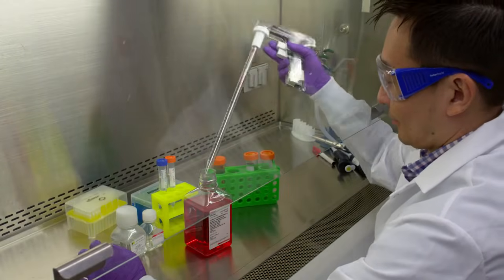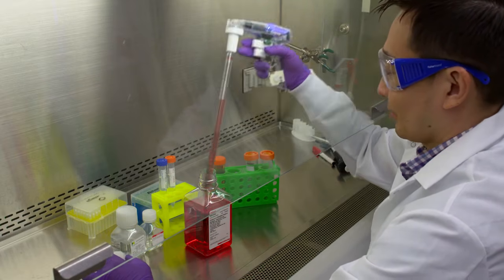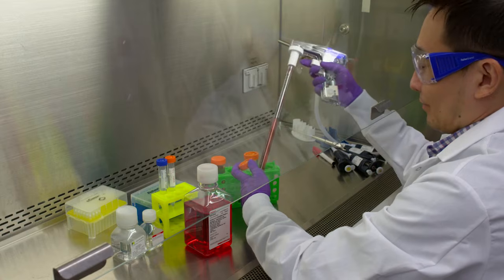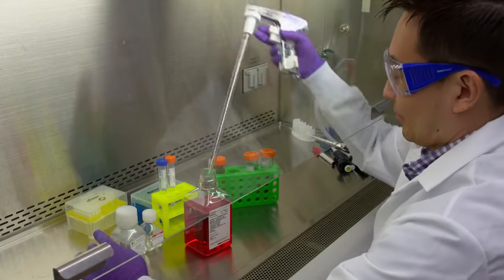Cell lines, although immortalized, have limited passage numbers before their genetic perturbation, which gives them immortality, causes them to change. For this reason, it is important to make frozen stocks often during the early passages. So how do we do this?